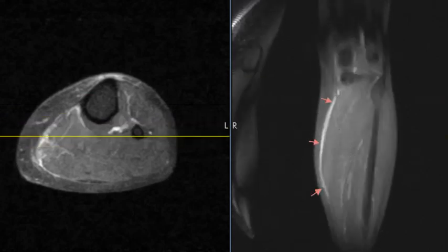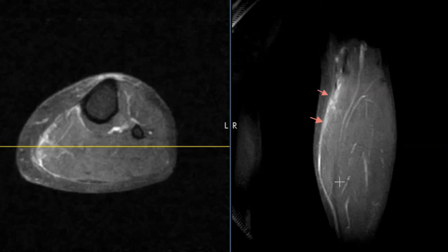This patient has edema and hemorrhage overlying the medial gastrocnemius muscle. This is the medial gastroc muscle here, and we can see distally things look pretty clean.